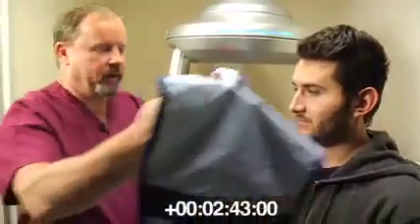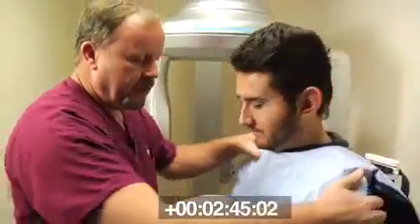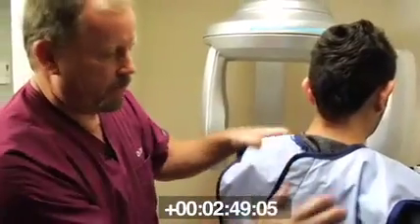So we're going to open up the door and get our patient seated, and then we'll show you how the scan actually occurs. Vince is ready to have his x-ray taken, so we're going to put a little front and back shield on him and get him as protected as we can. And we're going to complete our seating here.